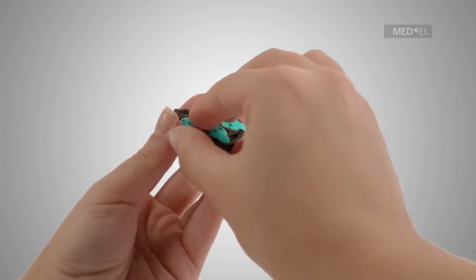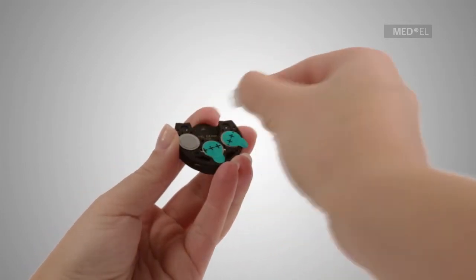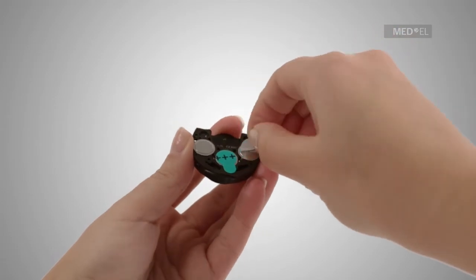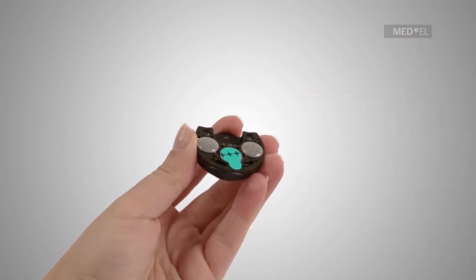The foil covering the zinc air batteries must be removed before use. Ensure that the plus pole is facing outward.